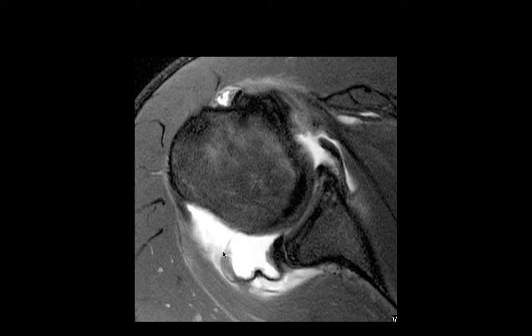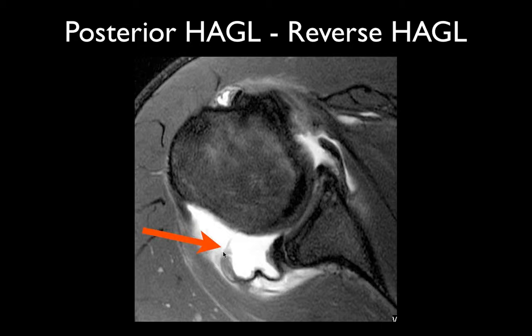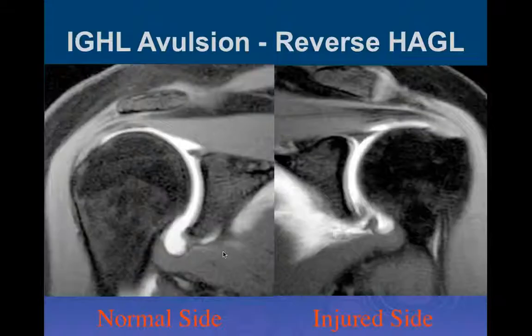Some people will come in with their arms straight out, right up, as if you were holding up the globe like Atlas does. Yeah, but this one's been reduced. And you can see a lot of other capsular injuries and injuries in the muscles surrounding it, as well as the labrum.